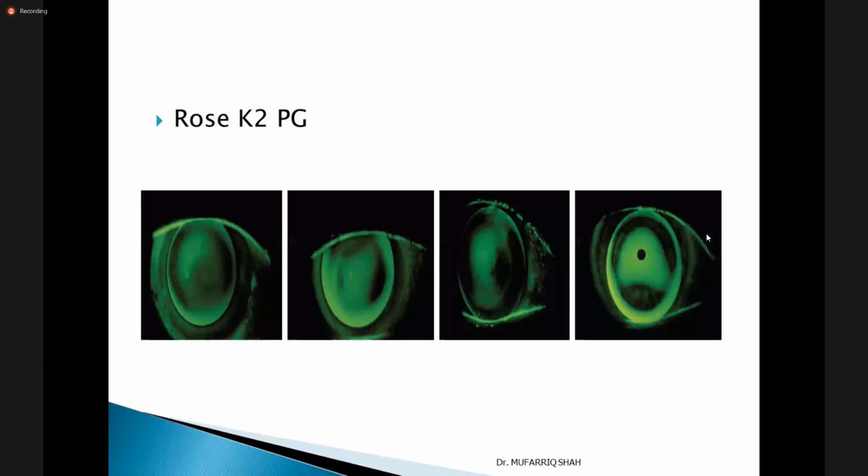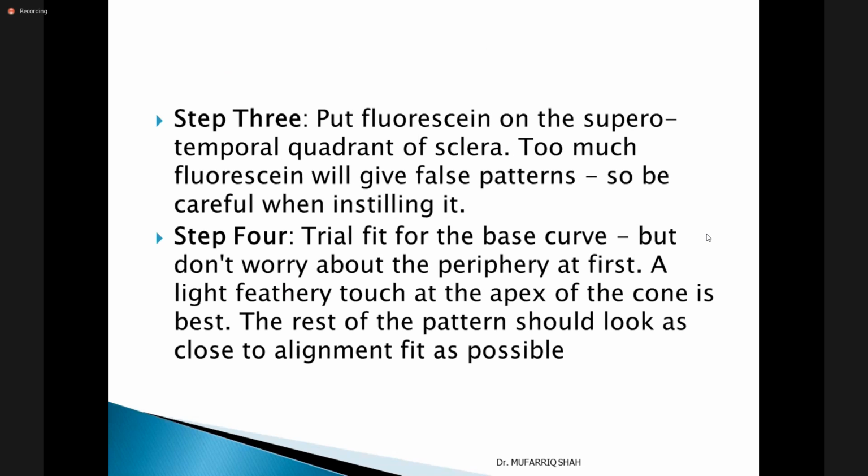Did you see here? I told you, too much fluorescein. So this will give you a false pattern. So be careful when you are instilling the fluorescein.